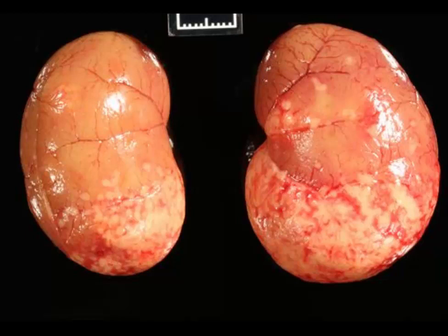Because they tend to be a little flat, and because they are tracking these vessels, if you said that this is a multifocal coalescing pyogranulomatous renal vasculitis and nephritis, you are correct.